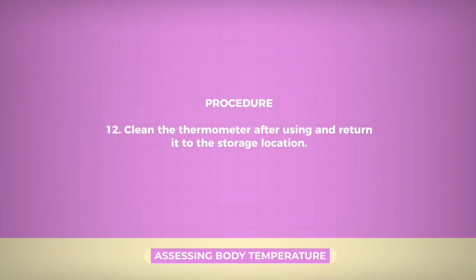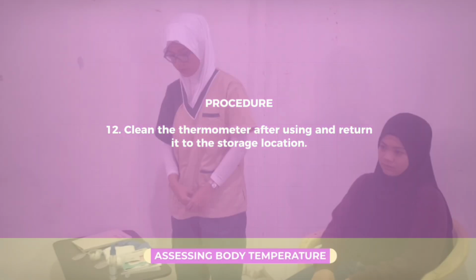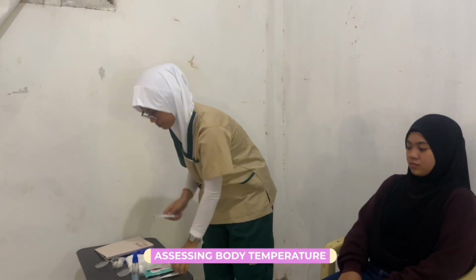After cleaning the thermometer, return it to the storage location. Proper cleaning and storage maintain the functionality of the equipment and prevent cross-contamination.